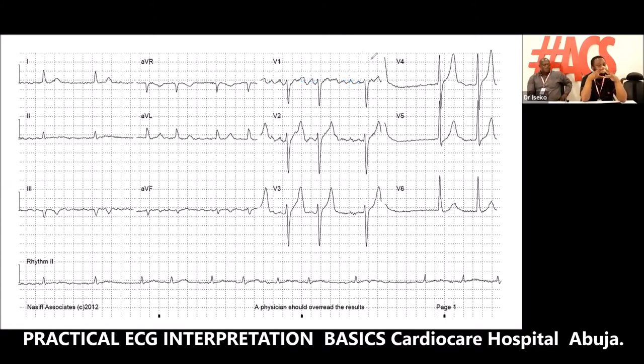Not really a fibrillation, but some people will still say fibrillation. So you are agreeing with flutter fibrillation. Great. ECG made easy. Then the axis before we leave it. The axis, yes. What's the axis?